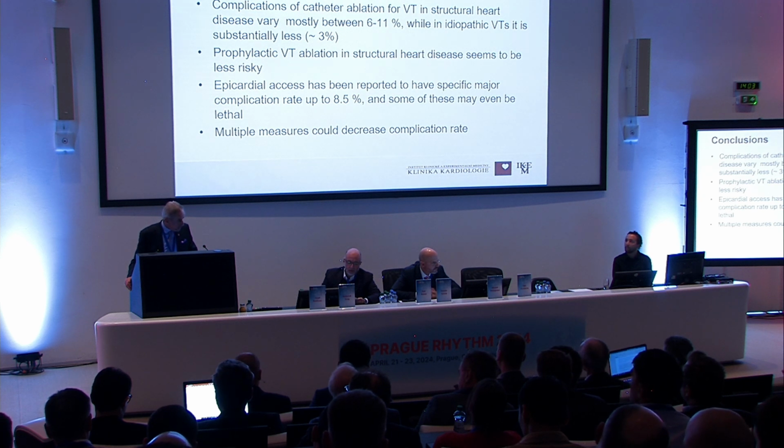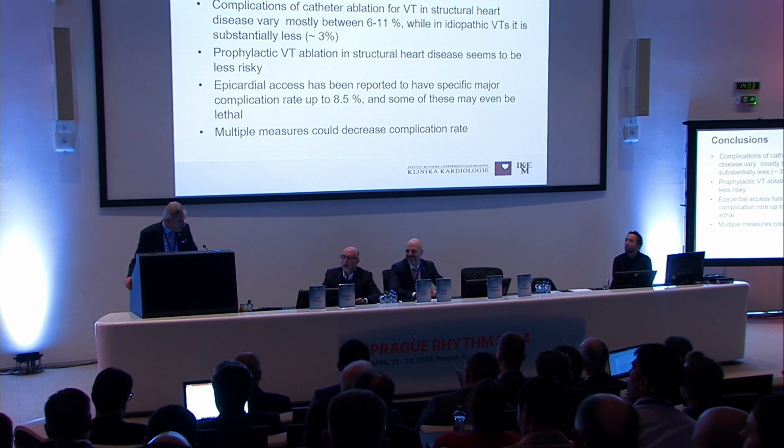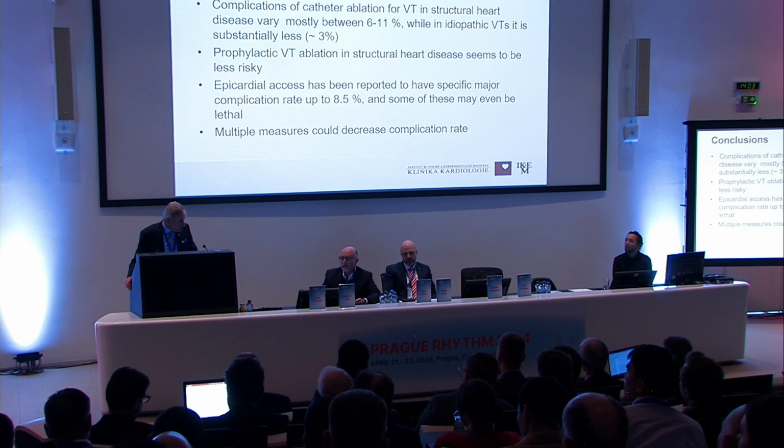I have a point of view. I think frequently we are asked if retrograde or transeptal it's better, if retrograde increases the risk of embolic events or not. What is your point of view regarding this?